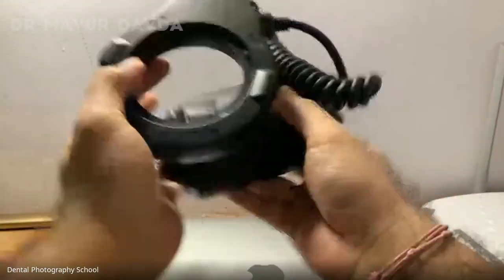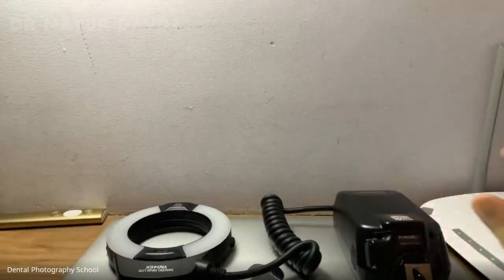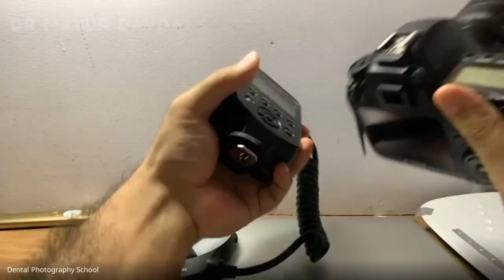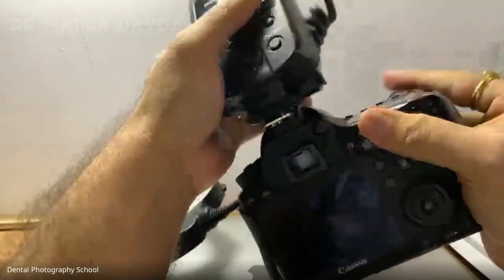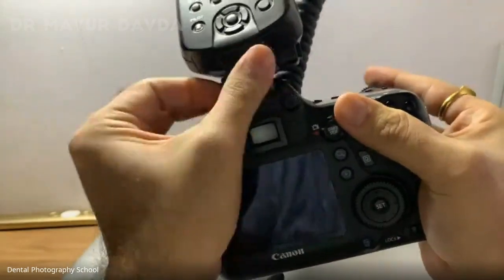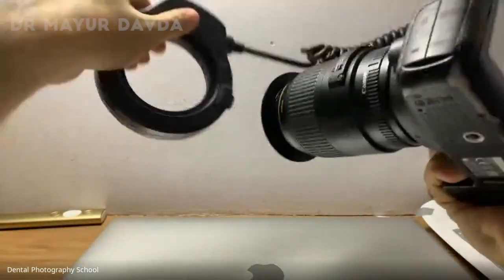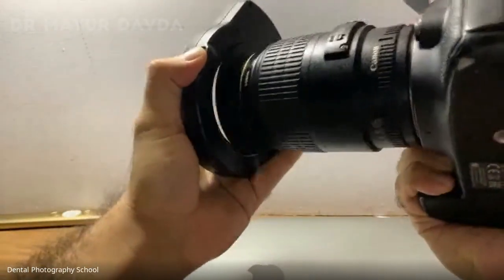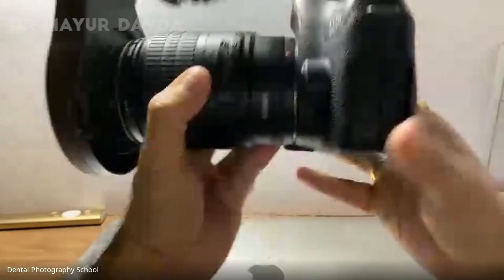So I'm going to be using this ring flash right now on my full frame DSLR. So the first thing that I'm going to be doing is putting my commander onto the hot shoe. I'm just going to slide it. I'm going to ensure that it's fully inside, and I'm going to start tightening the threads on my camera. And now I'm going to be taking the flash unit, and I'm going to be mounting it in front of the lens like this, and it's secure and it's really good.